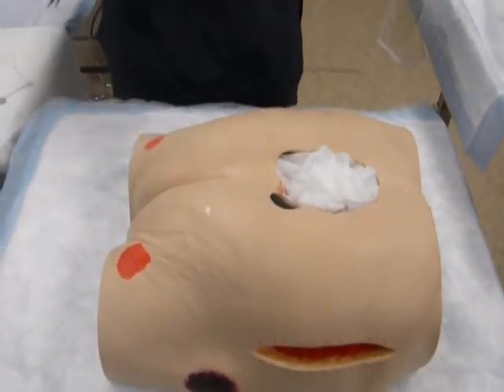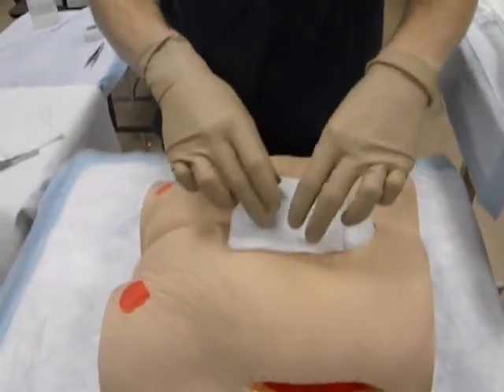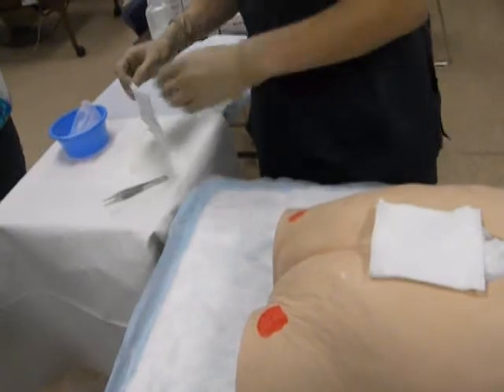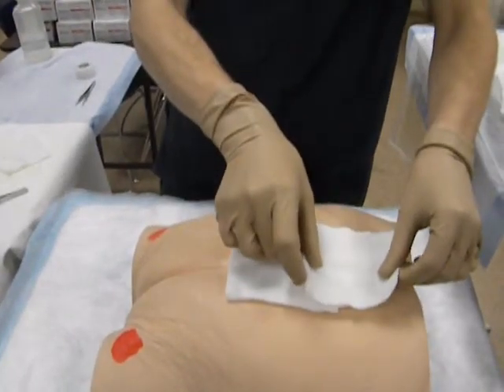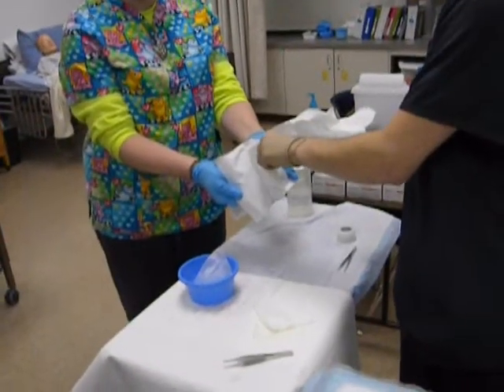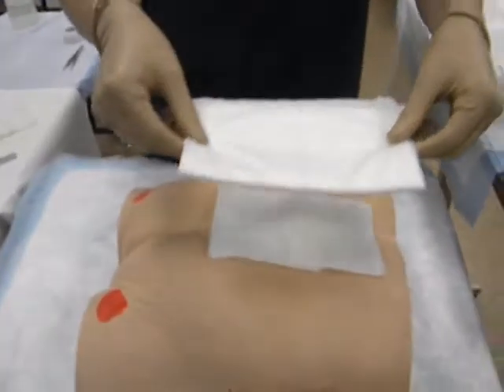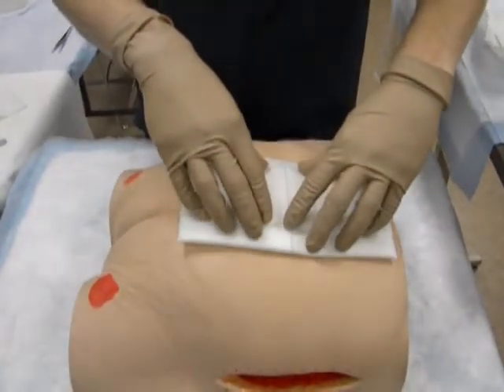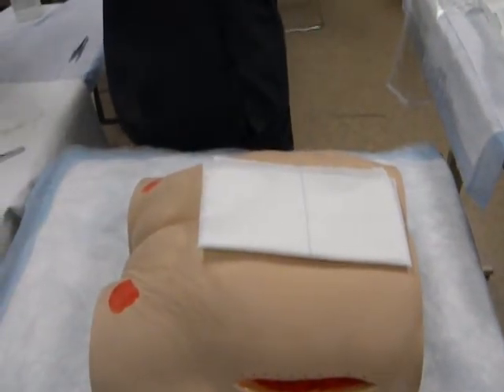Once the wet dressing has been replaced in the stage 3 ulcer, we will then cover that part of the dressing with dry, sterile gauze, approximately covering at least a 1-inch margin around the wound. Then placing a sterile abdominal pad additionally over that sterile dry dressing for proper and appropriate coverage.